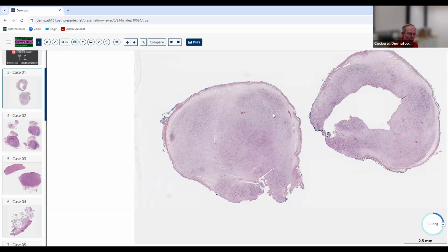So, do you think this is an epithelial or non-epithelial lesion? From low power, I'm thinking non-epithelial. Good. You don't see anything that looks like obvious epithelium or an adnexal structure, and you don't see cells that are closely opposed to one another. It's got a very pale, maybe loose mucinous stroma, and then some cells in the background that maybe are spindle. It's hard to be certain. I agree with you. It looks like a benign neoplasm, non-epithelial.